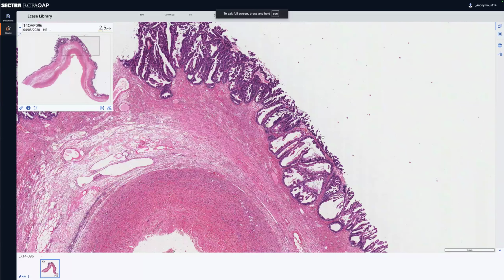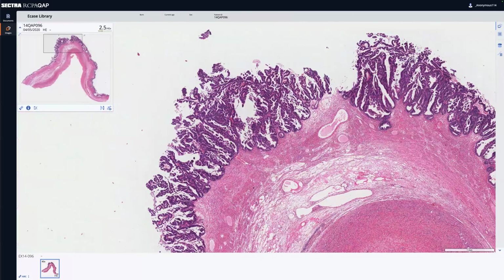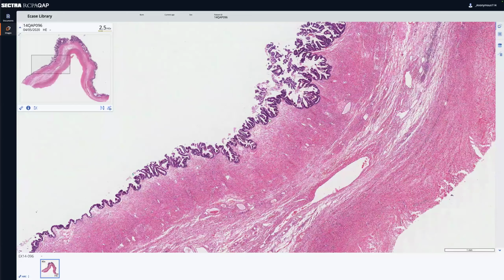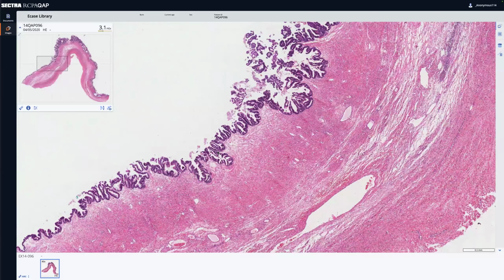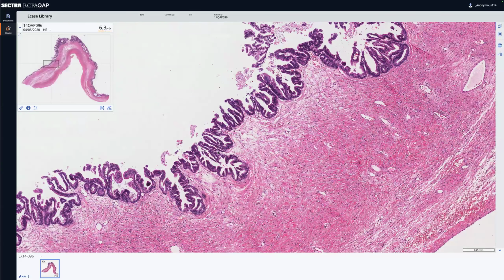We think this is borderline rather than carcinoma because there's no invasion. But often people ask, are there any adverse prognostic features in these borderline tumors? The most prominent adverse prognostic feature is that it forms carcinoma in situ within the lumen of the tumor.